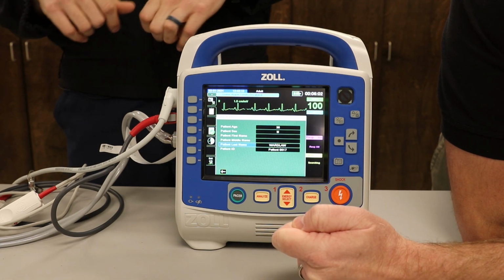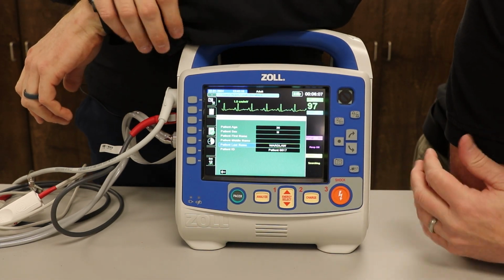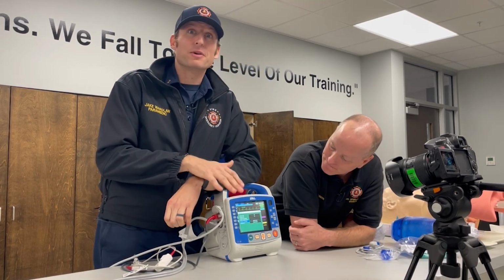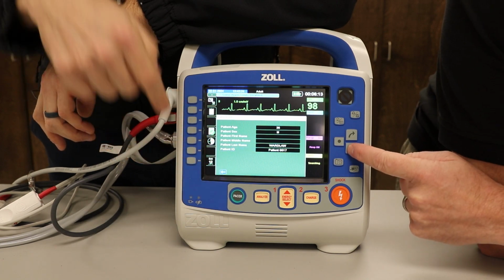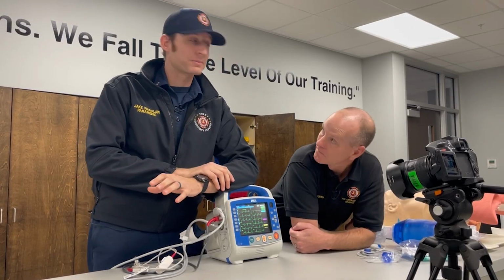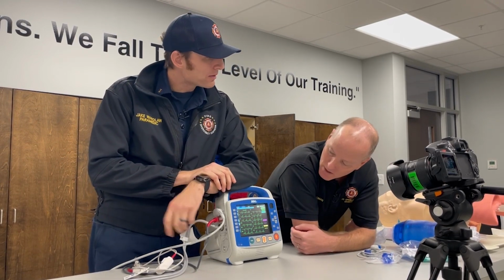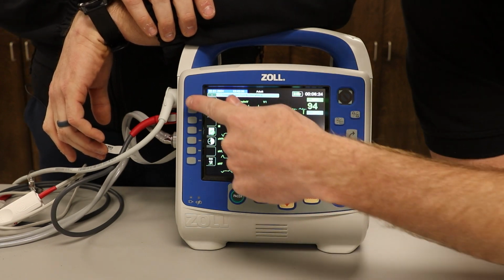So there's the Wardlaw. Now what do I do to get to that camera button to snapshot my 12 lead? We have to get off the actual demographic screen. So we're going to have to scroll down. Dave, if you want to scroll down to that arrow down here and select that arrow, now we have the capability of actually doing the 12 lead capture, right? Gotcha. So how do we do that? Well, it looks like a camera, since we keep using the word snapshot. So I'm going to snapshot them.